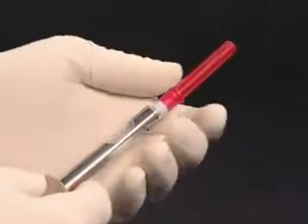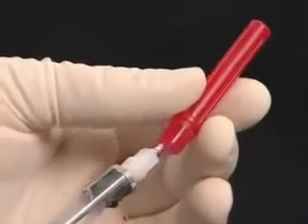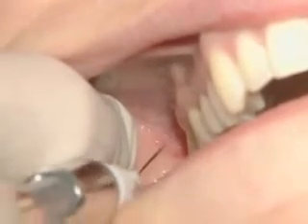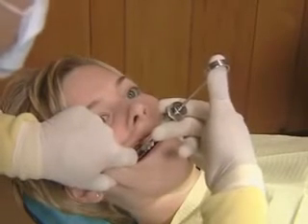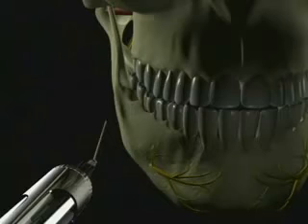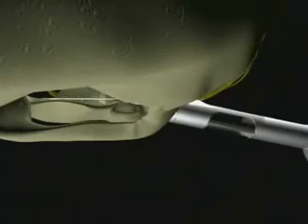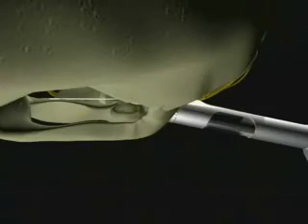To bend a needle, loosen the cap and then, using the cap in a sterile manner, give it one bend and one bend only, removing the cap to determine the final degree of bend. With the jaw closed and teeth together, the syringe inserts into the insertion point against the posterior mucosa. Once advanced in, the angle is corrected and the needle is advanced posteriorly 25 millimeters. The syringe should be at the level of the mucogingival junction of the maxillary molar, parallel to the maxillary occlusal plane, and as close to the maxillary mucosa as possible without touching it. The syringe is advanced posteriorly, with the bend in the needle drawing the needle tip closer to the ramus in an arc-like fashion. The greater the degree of bend, the greater the arc.